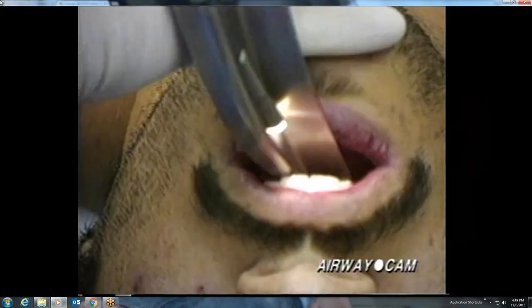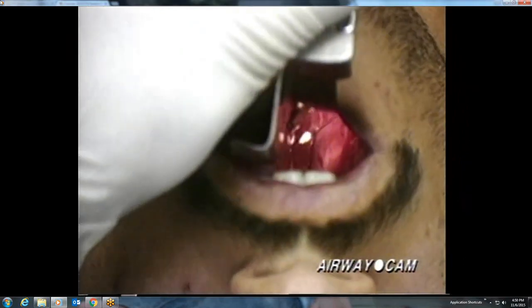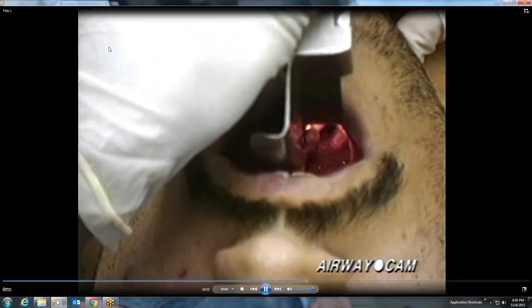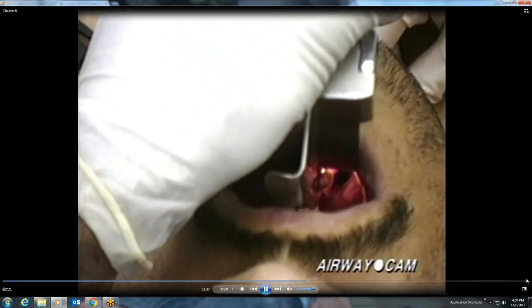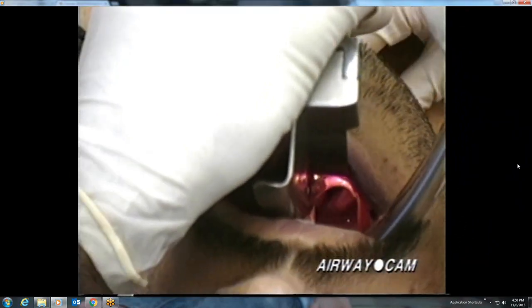The next case involves a McIntosh No. 3 blade. Following a push-off technique for opening the mouth, the blade is advanced further along the posterior pharynx and can be seen well away from the upper teeth. The epiglottis and posterior cartilages come into view surrounding the dark glottic opening. An assistant provides laryngeal manipulation and moves the posterior cartilages. The laryngoscopist pauses as the tube is directed towards the glottis.